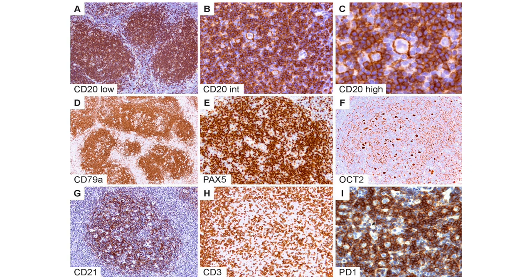CD21 in figure G defines the intact follicular dendritic cell meshwork within the NLPHL nodule. CD3 in figure H shows the background T cells with occasional ring formation. Figure I shows a very nice PD-1 staining demonstrating rosetting around the LP cells.